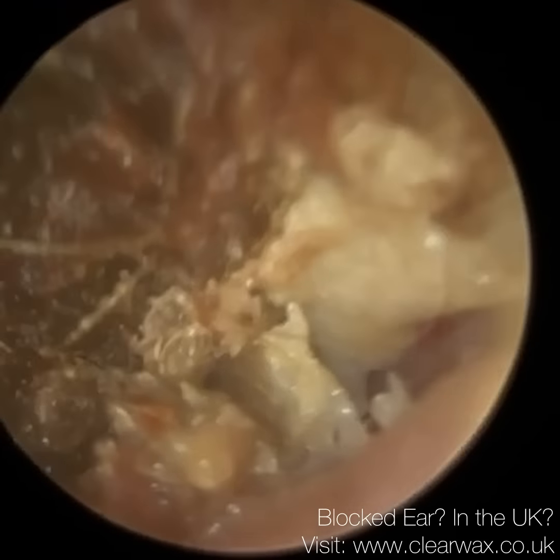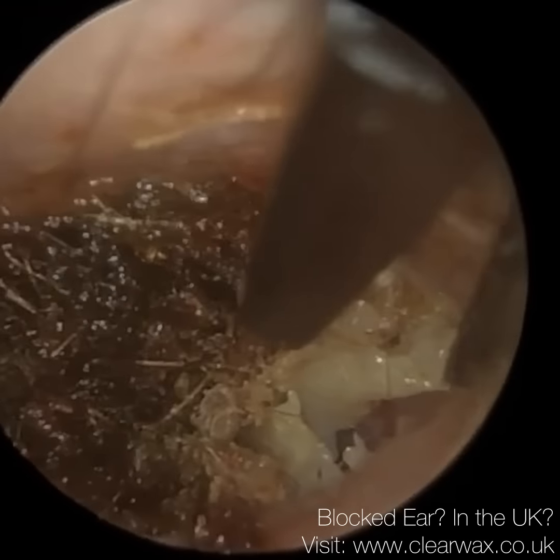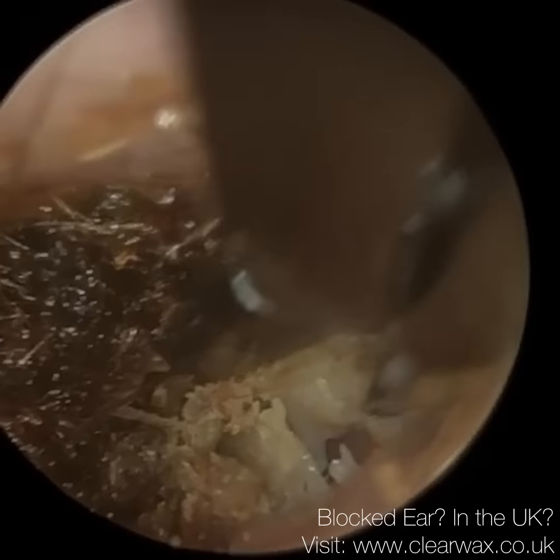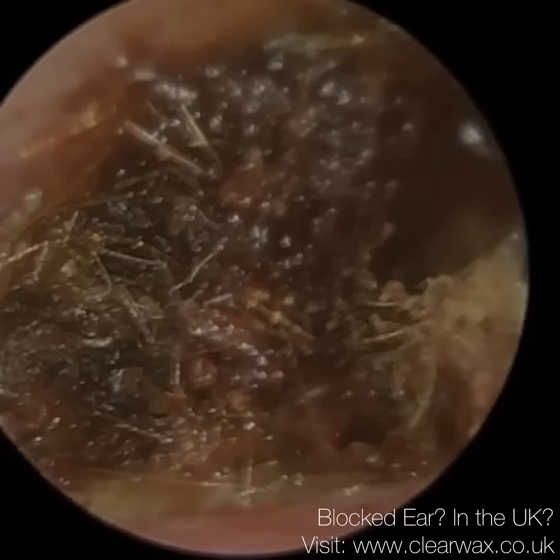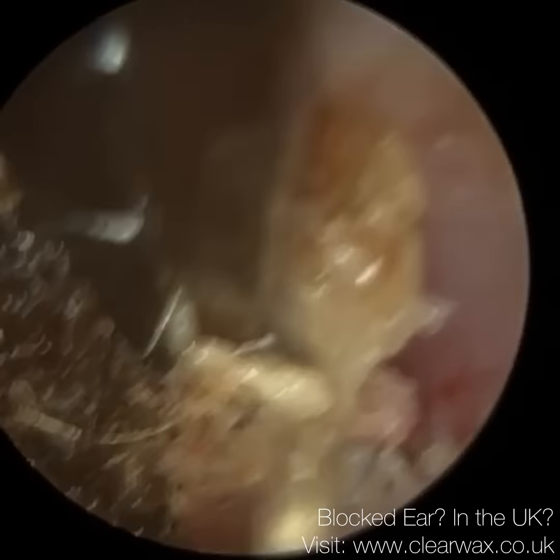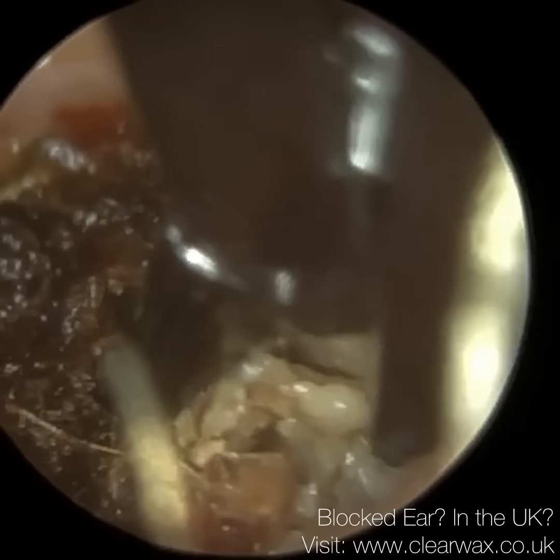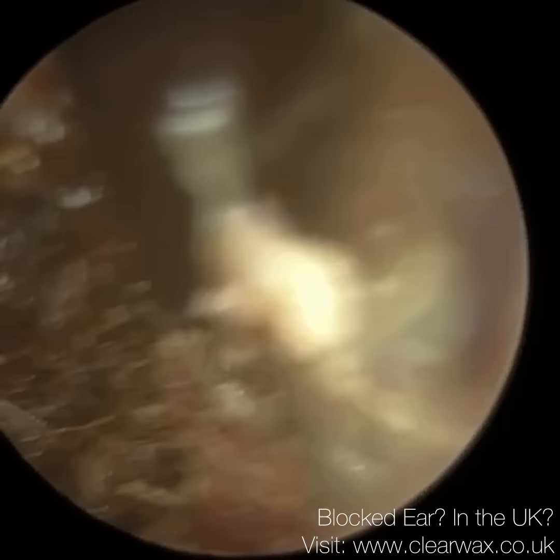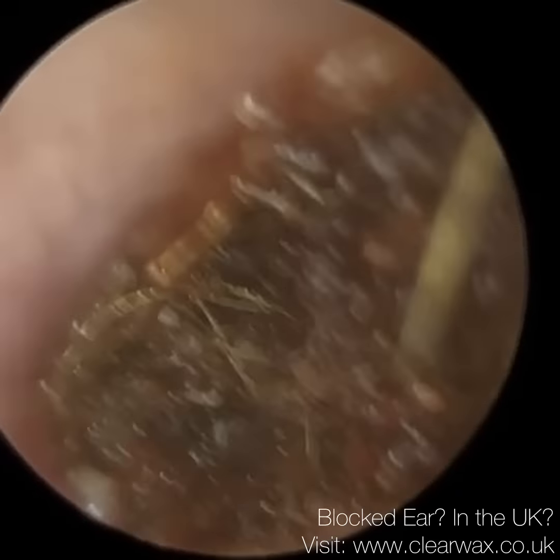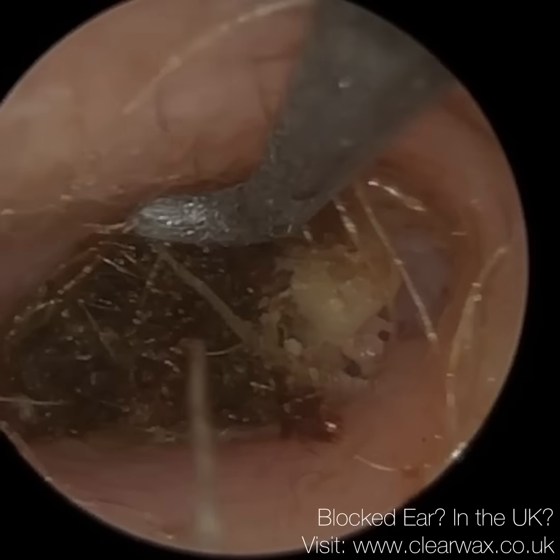Now, the main, for me, diagnostic or clinical symptom of keratosis obturans is the feel of it when you're in the ear. And I could just tell this had this rubbery ball consistency, which is typical, again, of a keratosis obturans. So keratosis obturans is a buildup of desquamous skin cells. So when we say desquamous, we mean shed skin cells.